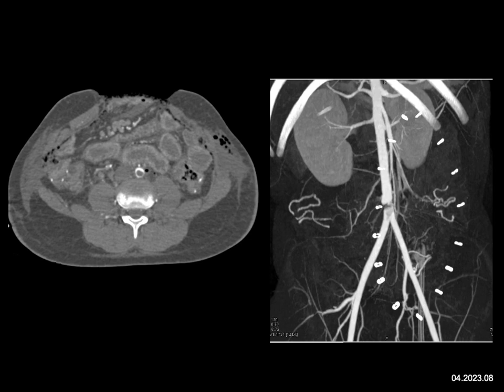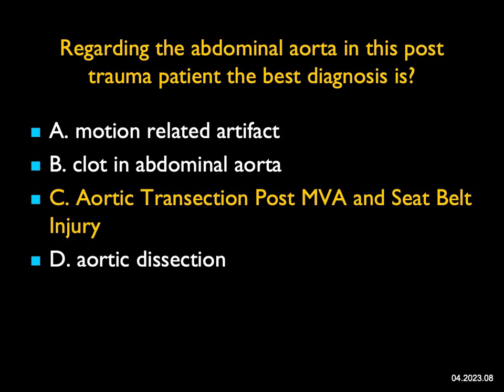Regarding the abdominal aorta in this post-trauma patient — on the axial there appears to be a clot, and on the MIP coronal there's a step-off that initially seems like artifact or motion, but there's no motion elsewhere in the image. It's not simply a dissection flap. The best answer is aortic transection post-MVA from a seat belt injury, near the umbilical level. The patient was lucky — the aorta remained intact, no massive bleeding, and they were eventually stented.